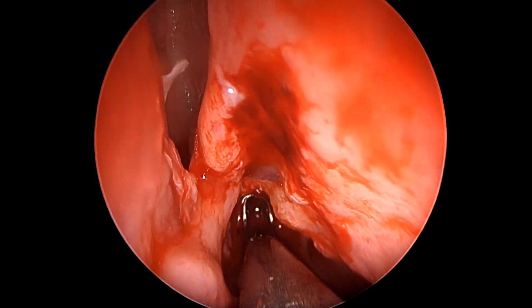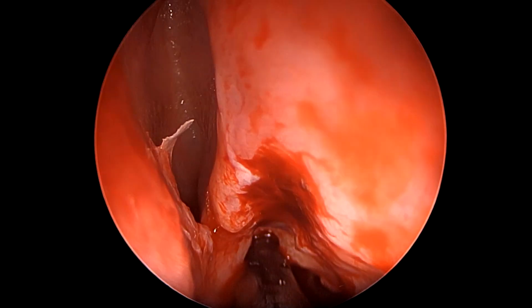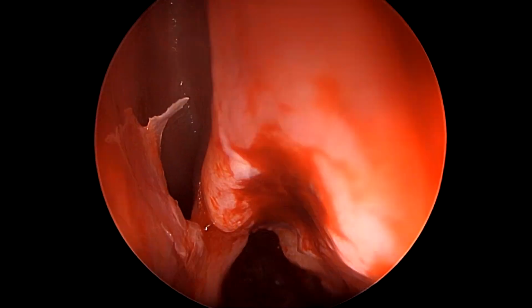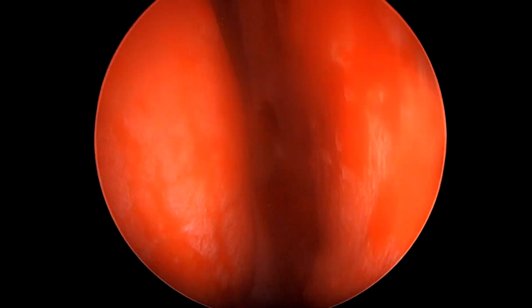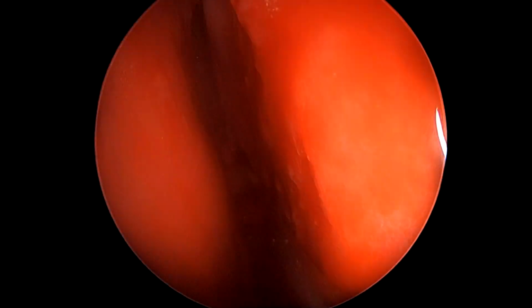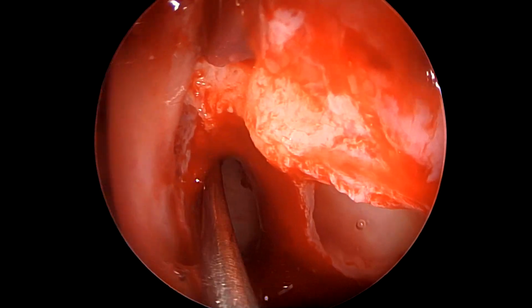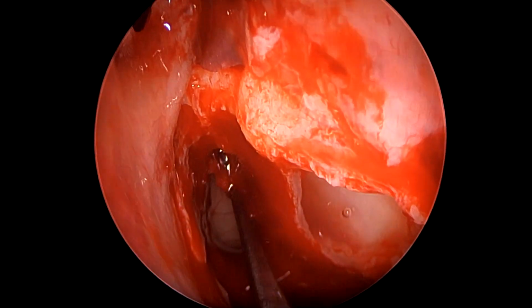Now to again gain some space and some instrumentation space, we are slightly removing the frontal beak, again with an articulated punch, because this frontal beak was impeding our vision and our access inside that area. But once we use the articulated punch to remove the frontal beak, we are able to see better, and the instruments get better leverage and a better trajectory inside that tight region to be able to do what we want to do, which is basically to remove the anterior wall of the suprabullar cell.